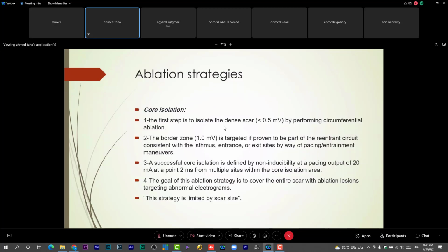Okay, let's talk about it. You have identified the potentials, the LAVA, the extrasystoles, by all the maps that we have discussed. So now I am getting to the ablation. What's my target? You need to identify the target, and this should be according to every patient. So it's an individualized protocol, like a strategy. Every patient has their own protocol.